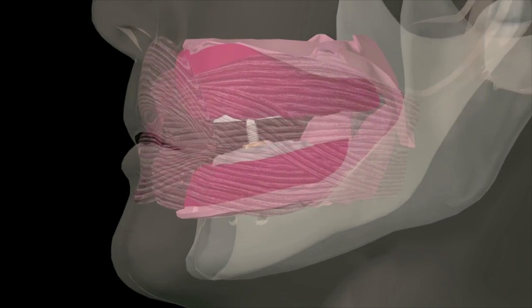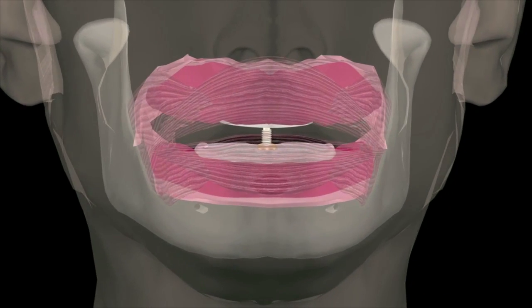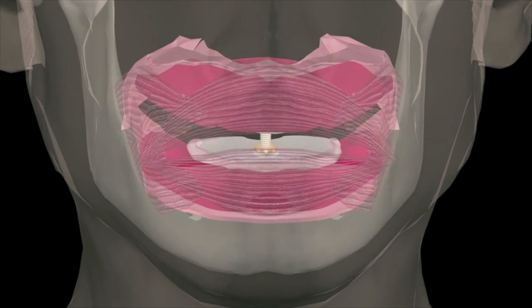With the Mossad jaw recorder mounted, the patient's jaws can be stabilized in space, and mandibular movements can be recorded at a desired vertical dimension.